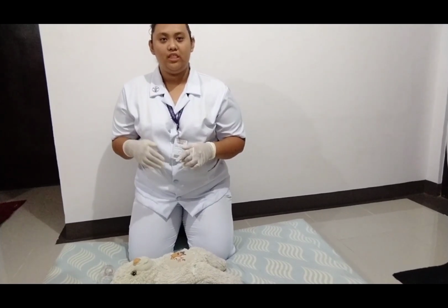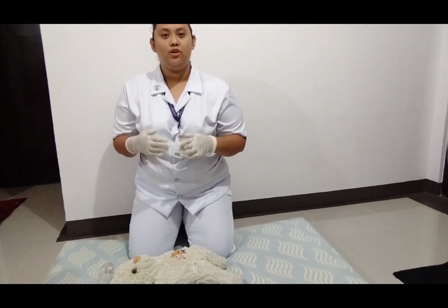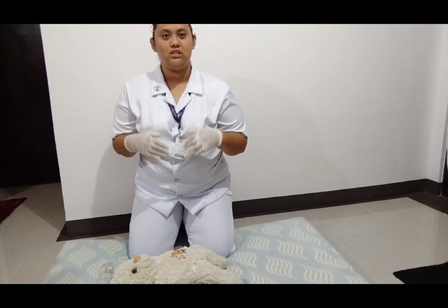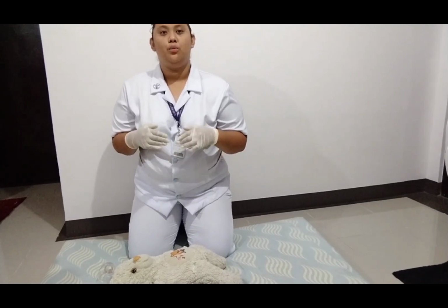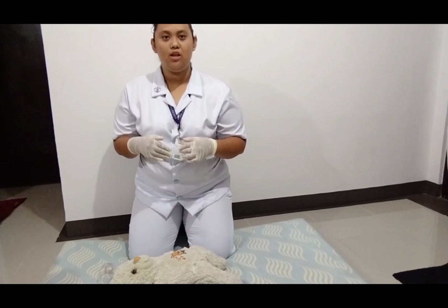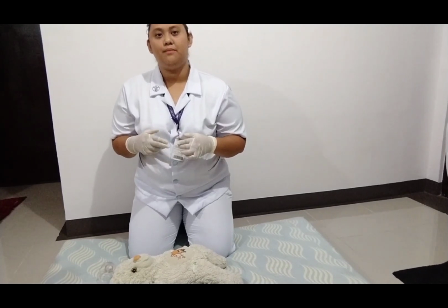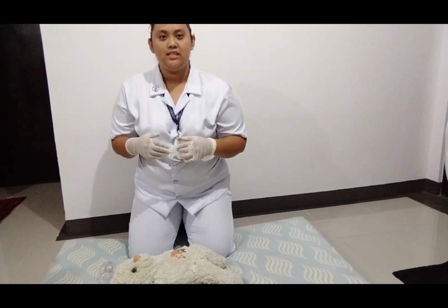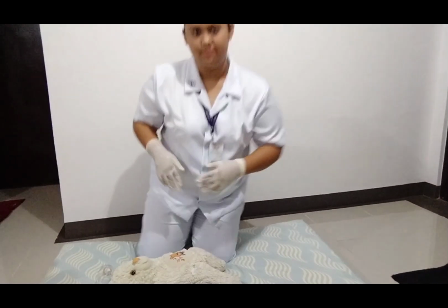the airway, breathing, and the circulation. We'll have to open the patient's airway. So if the patient is wearing constrictive clothing, we'll have to loosen it up. We can also do the head tilt, chin lift to open the airway. Now, after doing that, we'll have to check the patient's breathing using the look, listen, and feel method. Look for the chest rise and fall, and then listen for the breath sounds, and then feel for the respiration of the air.